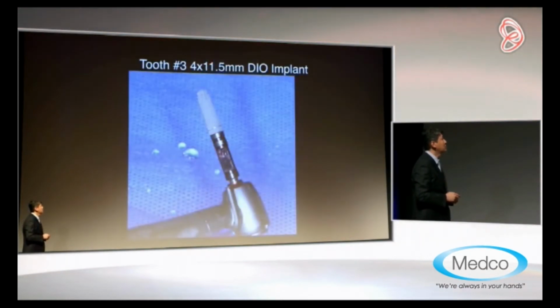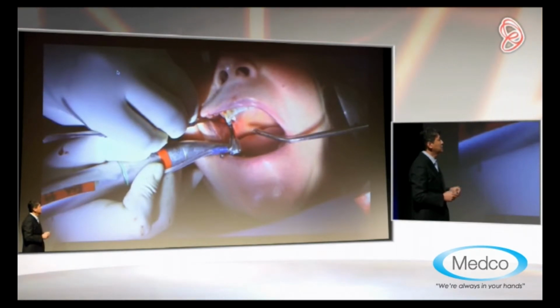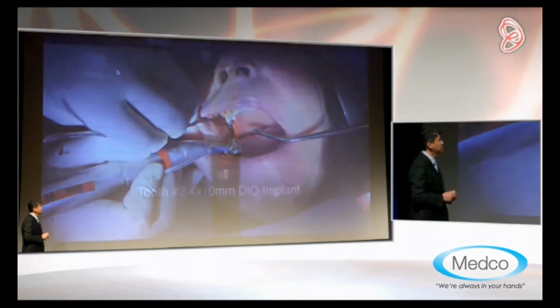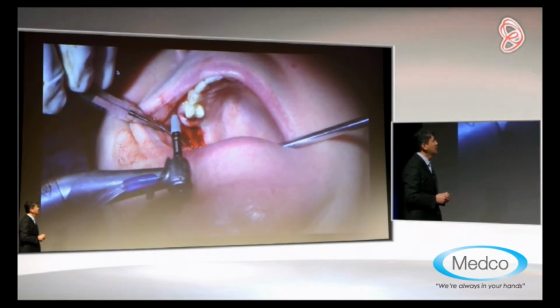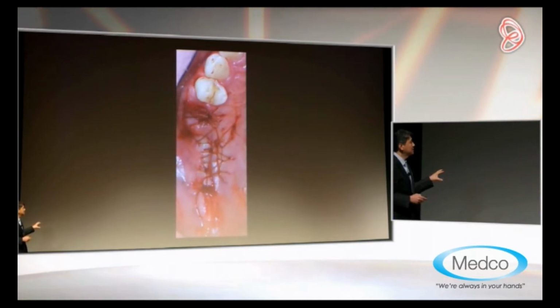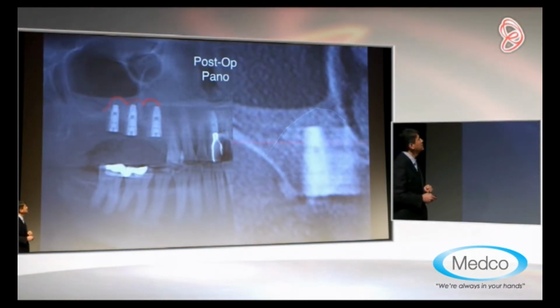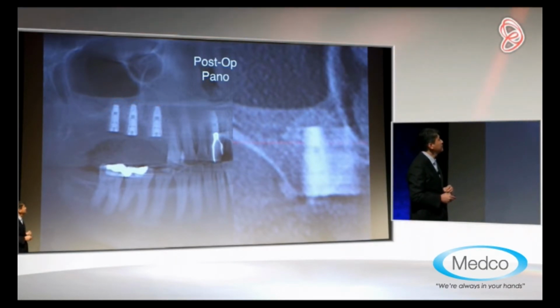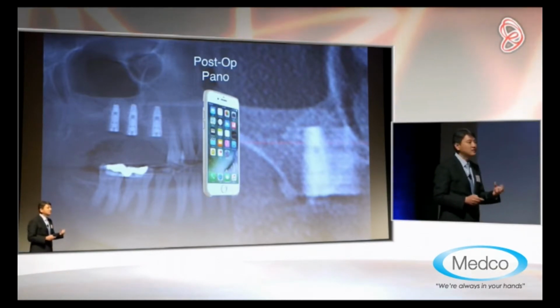So 2 more implants have been placed, and I will just skip the implant insertion, and primary closure has been done. And as you can see at the final X-ray, patient has received very, very predictable sinus lift procedure. So this is truly the iPhone 7 of sinus lift.